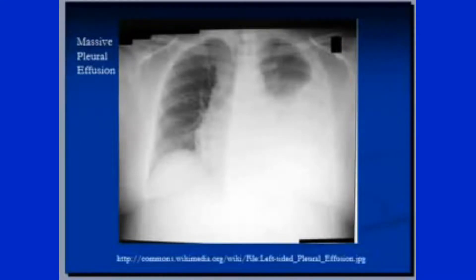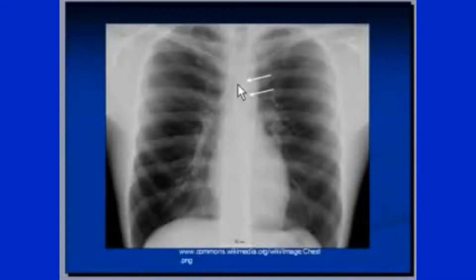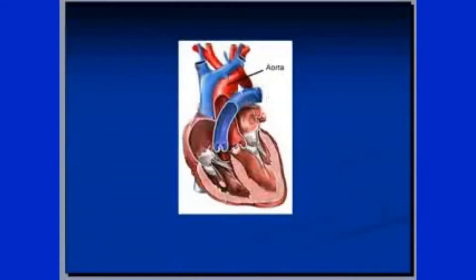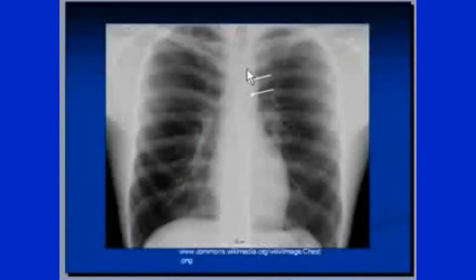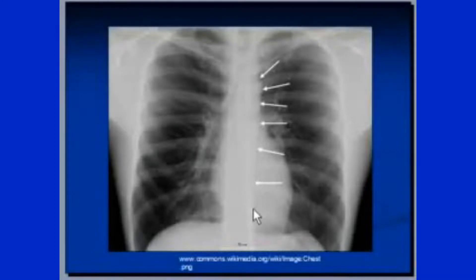Just before bifurcation, the trachea is always pushed towards the right to accommodate the aortic arch, which is visible here. The rest of the thoracic aorta is visible as a sharp line moving towards the midline to enter into the abdomen through the diaphragm.